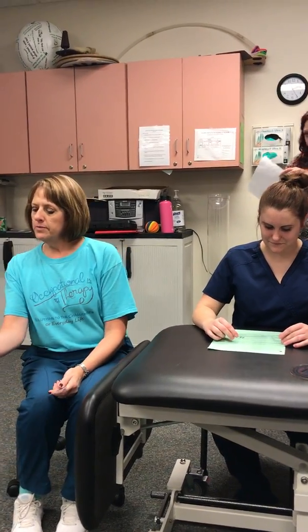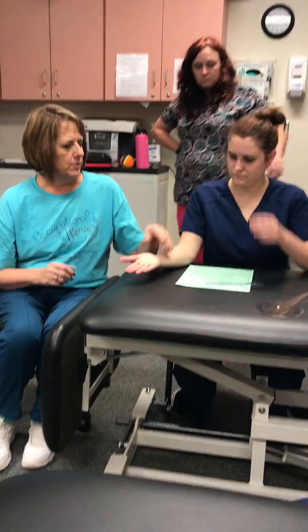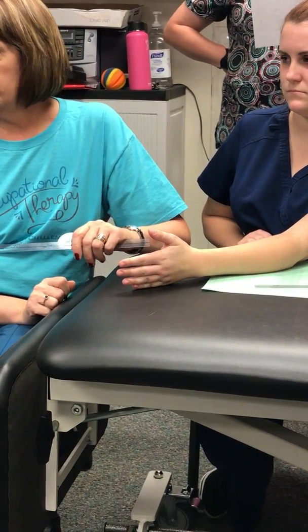Remember when you're in anatomical position, extension and flexion happen parallel to the palm. So when we start this one, we're not going to be at zero — this is one of these tricky ones.